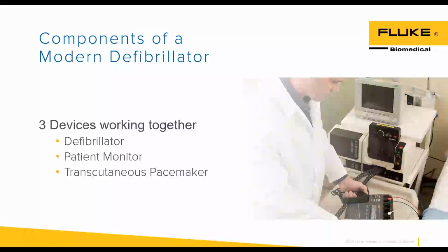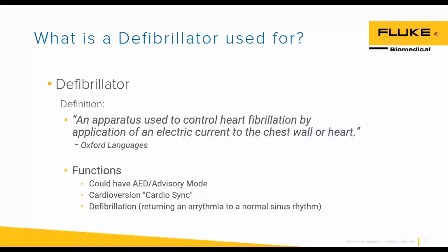And now another little hint: do you have the right protocol for your CPR in your AED or defibrillator? And again, we'll bounce on that a little bit more. So what is a defibrillator used for? Let's break this down. Let's start talking about these three sections. What's that defibrillator used for?